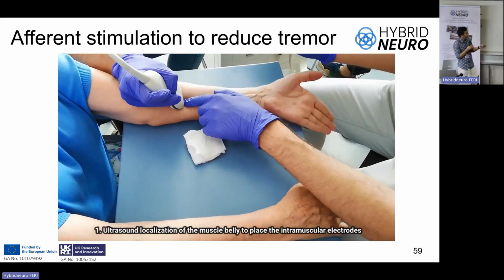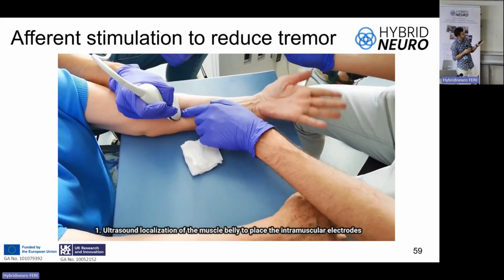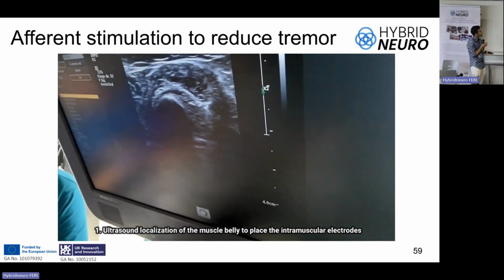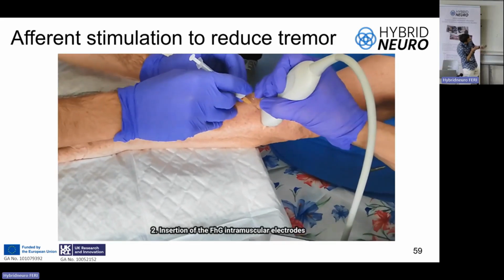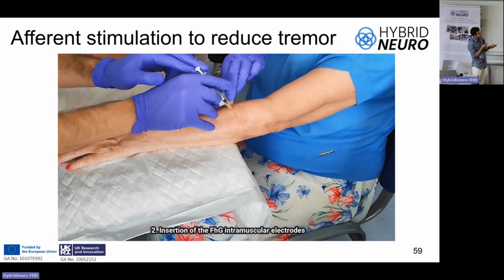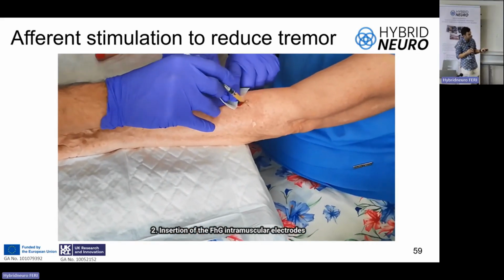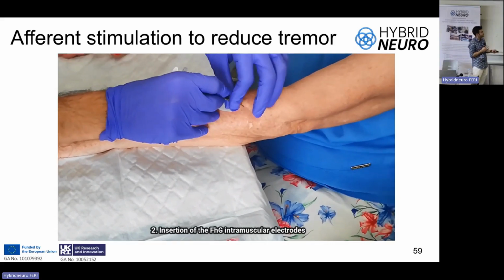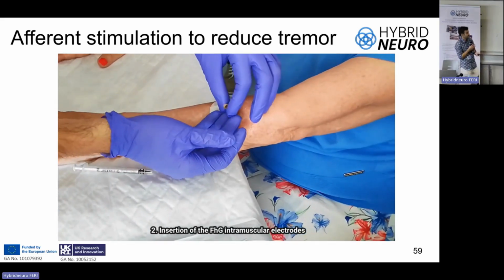So on the one hand, we did the insertion of the intramuscular electrodes, made by the physician with ultrasound. We identified the flexor carpi radialis, extensor carpi radialis. And as you can see the needle going through. It seems painful, but the patients actually reported, out of 10, a pain of 2 on average. So it's not painful. We are always grateful to them because they are really nice, willing to help whatever the conditions and the length of the experiments.